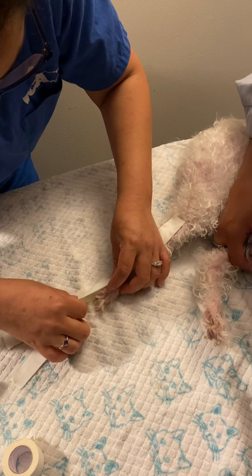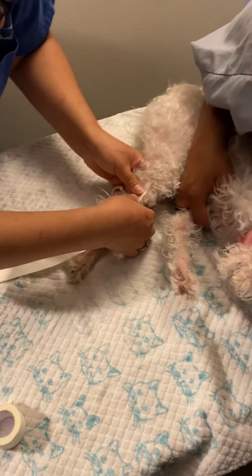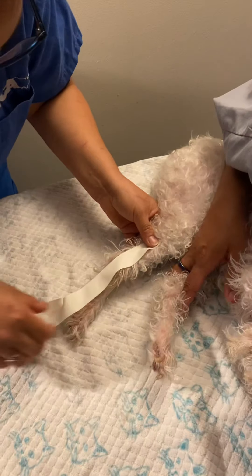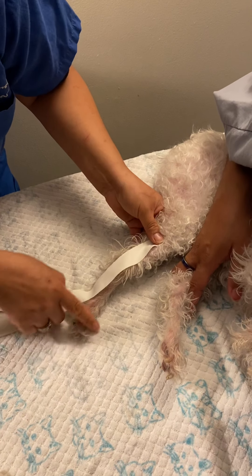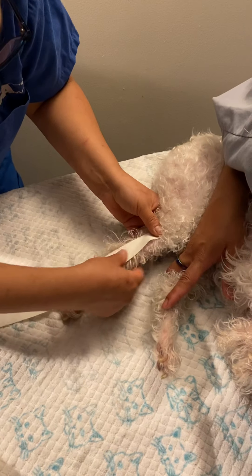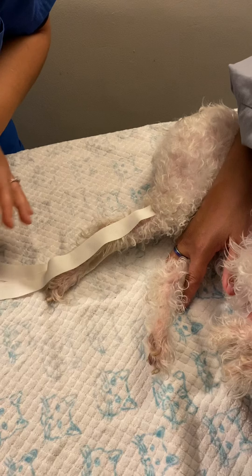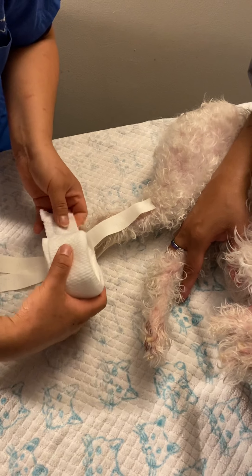Before we start our bandage, we just want to make sure some of her toes are exposed so we can check for heat, discoloration, and any swelling. We're going to start with our cast padding and go from the bottom to the top of her leg.